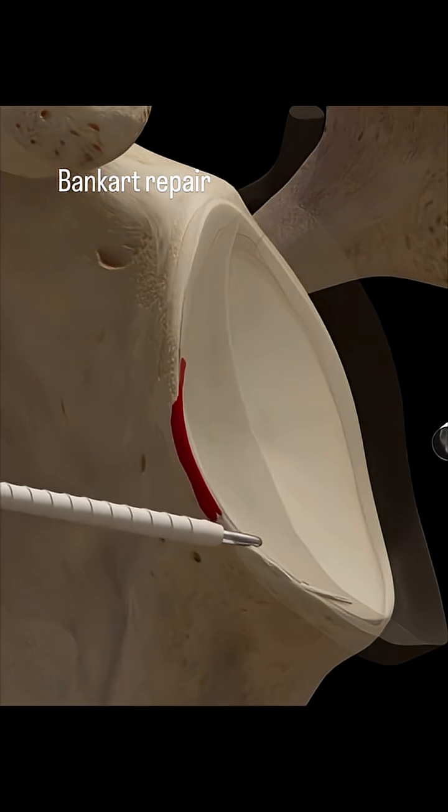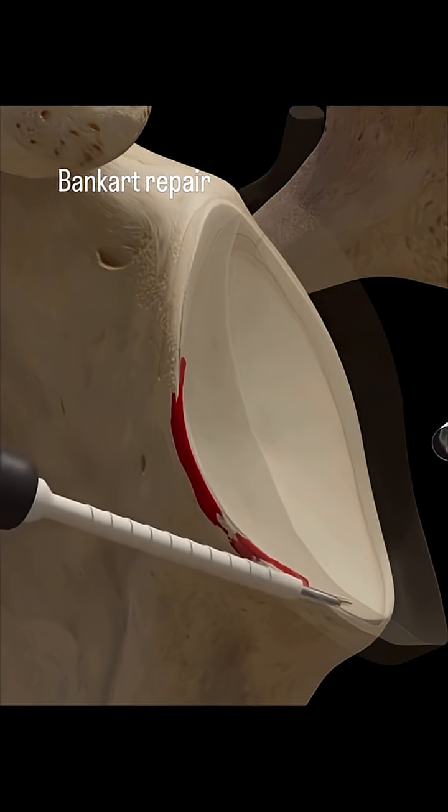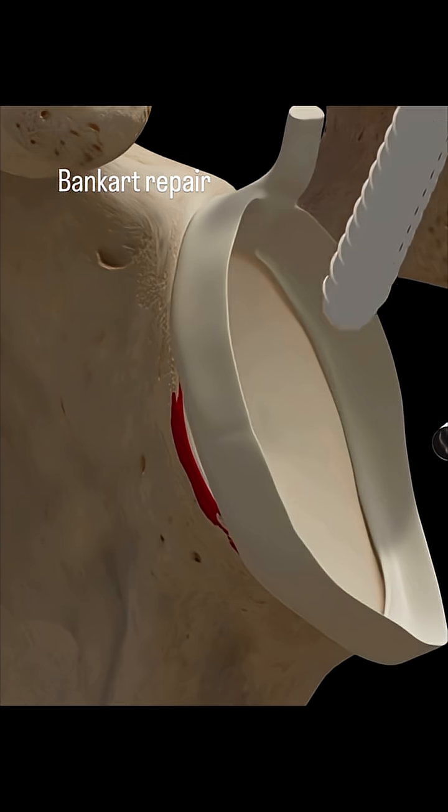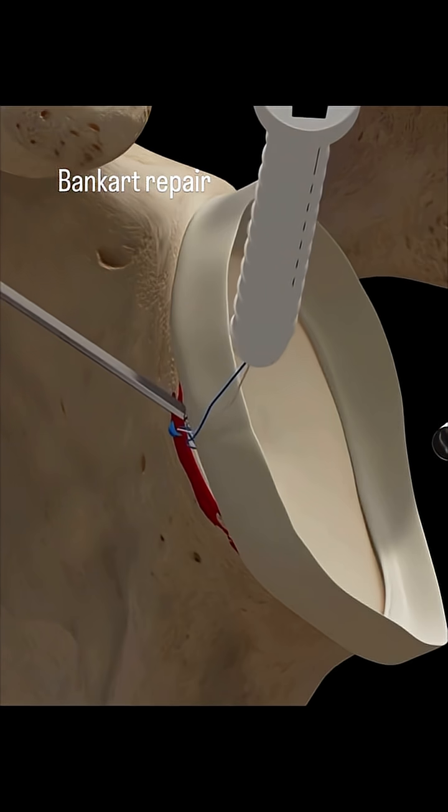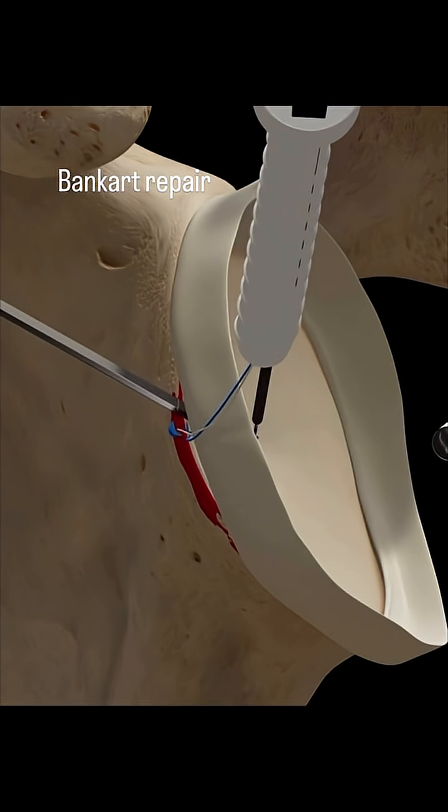Next, the labrum — that crucial C-shaped cartilage — is shown attached to the glenoid socket. A new set of instruments appears to prepare the area for repair. Once prepared, we can see distinct markings and small blue dots along its edge, indicating the anchor points for the procedure.